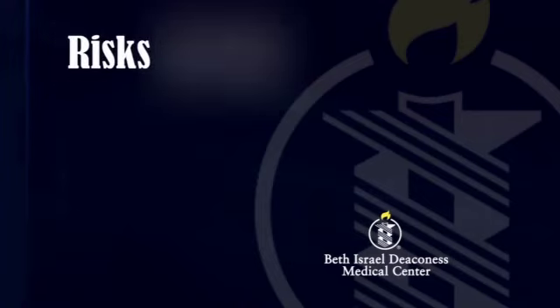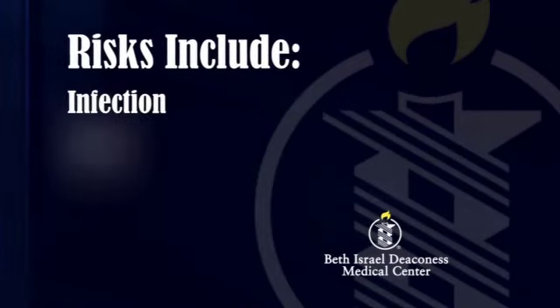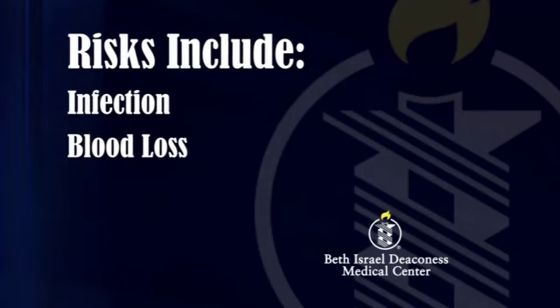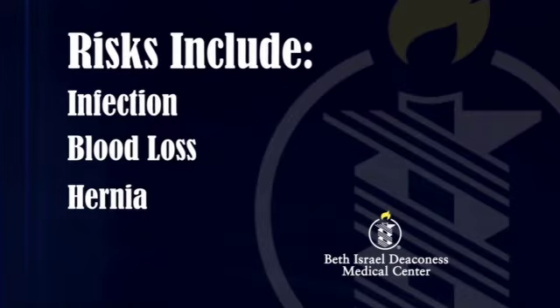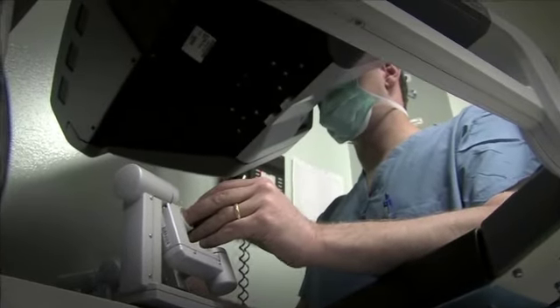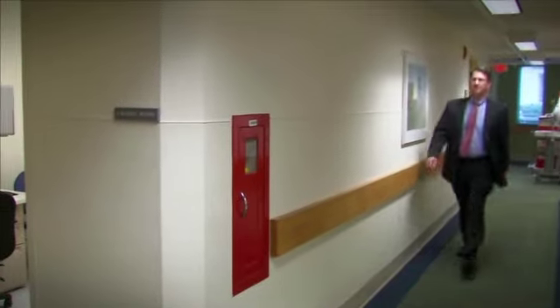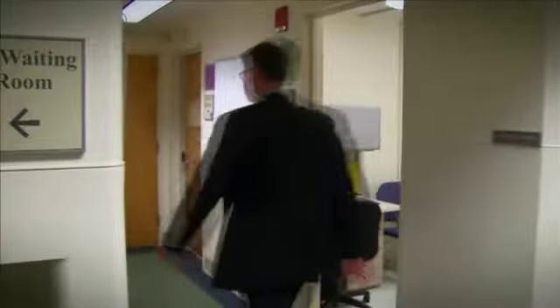As with any surgery, there are risks, infection and blood loss, although with 1 small incision, the concerns may be less. There may be an increased risk of hernia. Some patients may also not be a good fit for the robotic procedure, including those who are obese. So far, studies suggest most patients have similar outcomes with the robotic surgery as with the minimally invasive technique, but with less scarring and with 1 incision rather than 4, a quicker return to normal activities. The advantage of that is less scarring.